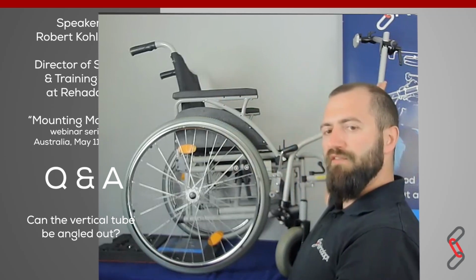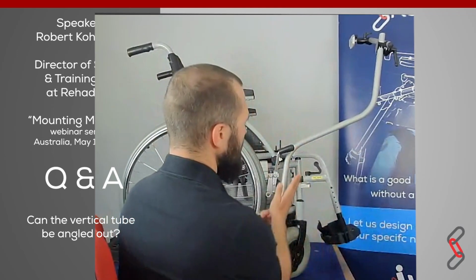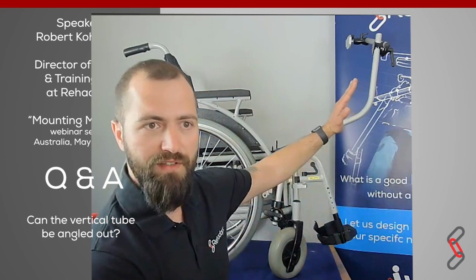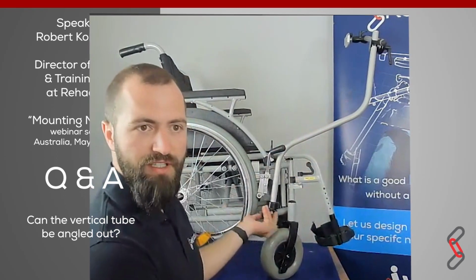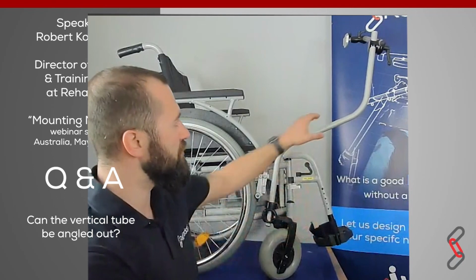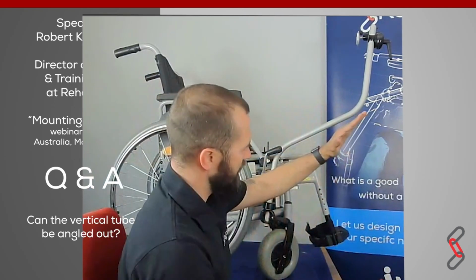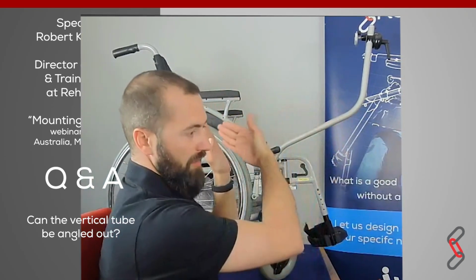If we are moving it forward into an angle that goes a little bit more forward, that will most of the time mean, when we are opening that swivel joint on the base of the first tube, that there is a little bit more and higher risk that when the tube is moved forward, it will rotate very, very fast to the outside. And there could be a little bit of a risk for the environment that the communication system drops to the side, if that makes sense.